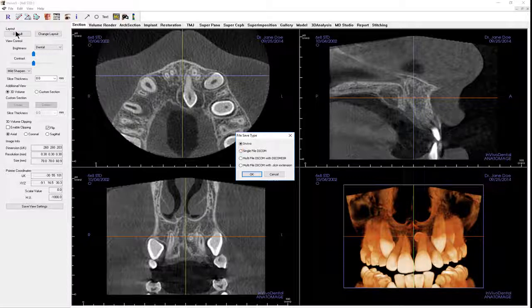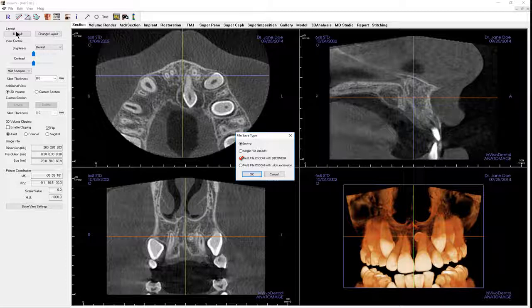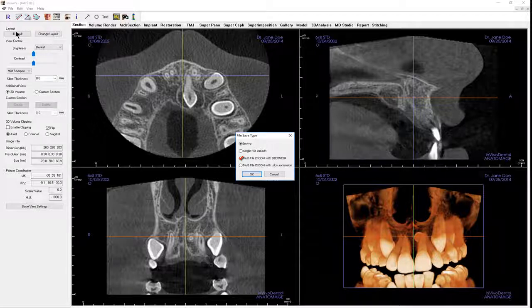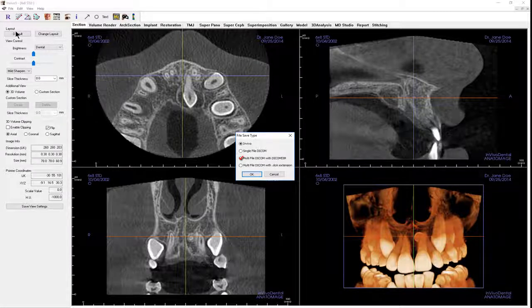The multi-file with DICOM DIR saves hundreds of 2D images or slices acquired during a scan in separate files, constituting a 3D volumetric image. Files of any workups made are saved as well. DICOM DIR enables a scan to load faster, but since files are extensionless, certain software programs may not detect it as a DICOM file.